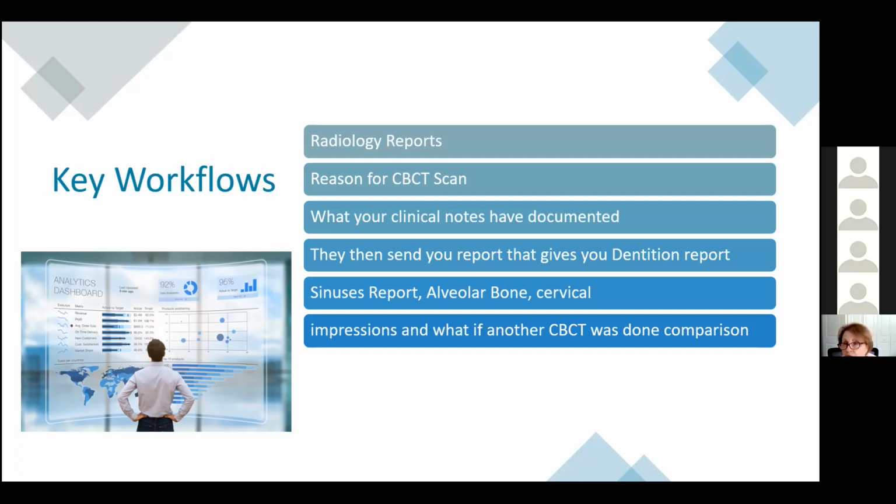What are you looking at? And if this patient, which I'm so excited about the radiology DentalRay being able to do, is whether you should refer the patient out for more tests or another doctor to collaborate, or can you do treatment with no other indications of problems that are going to impede you from moving ahead.